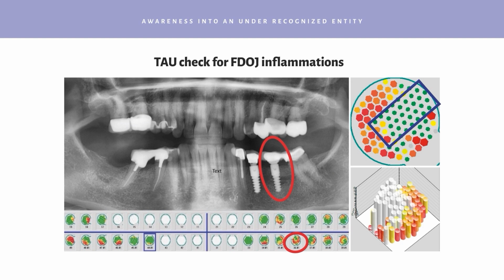And I want to focus on this left lower jawbone area, just on this titanium implant. On the printout below the X-ray, in this area, we call it number 36 in the European terminology, you see these red spots. And these red spots, you see the magnification on the right side.